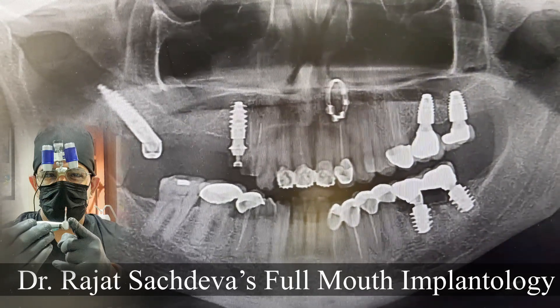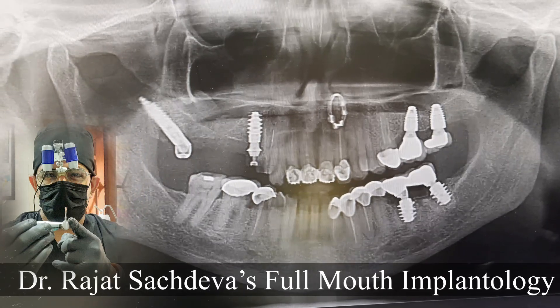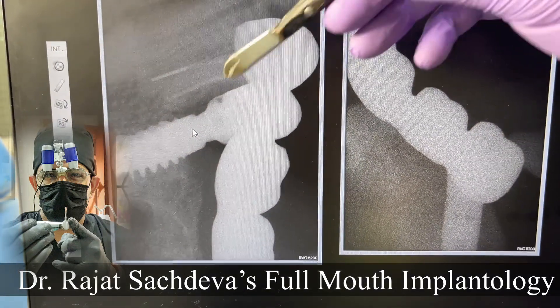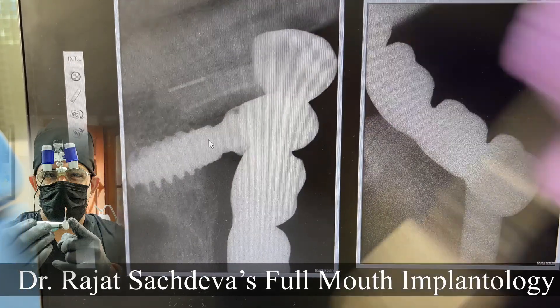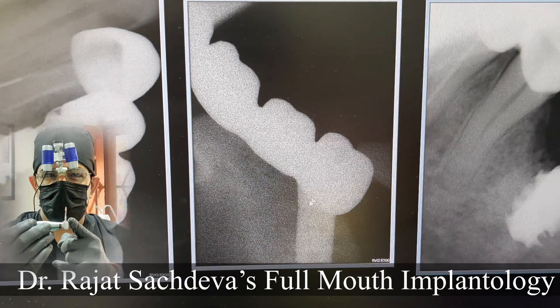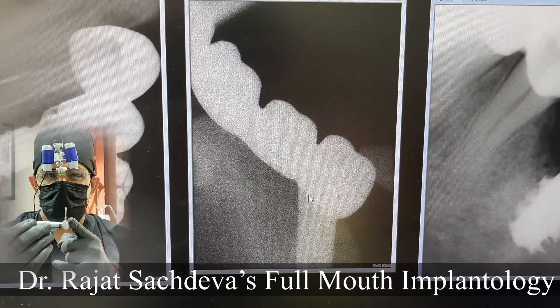Now I am going to show you the fitting that we have taken a trial of. This is the fitting that we have to verify from IOPA. This is on the premolar implant — the last implant — and the pterygoid implant.